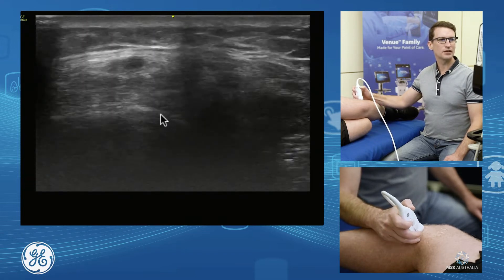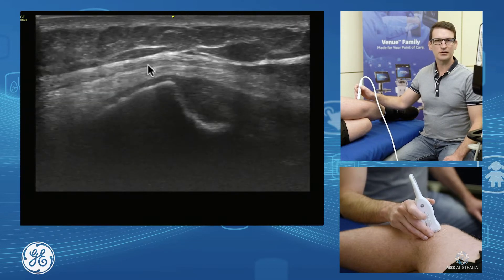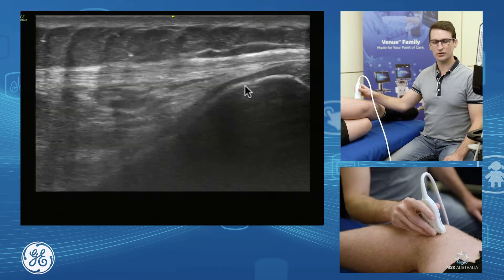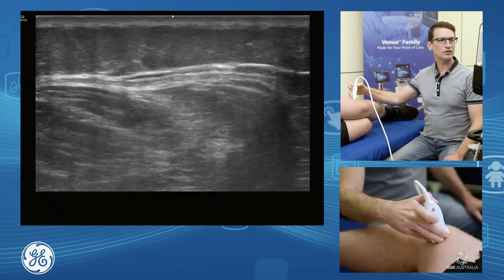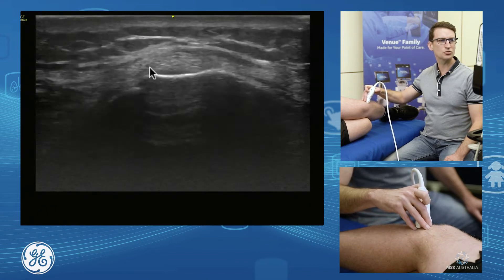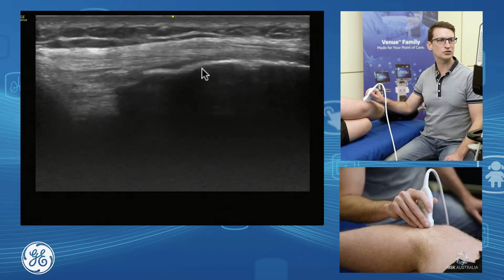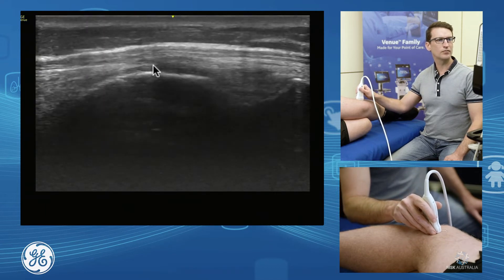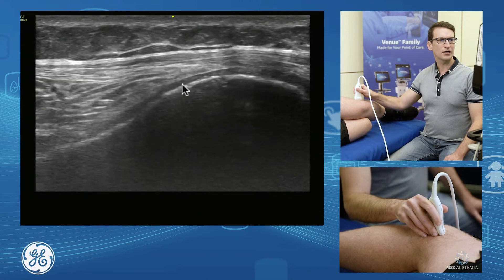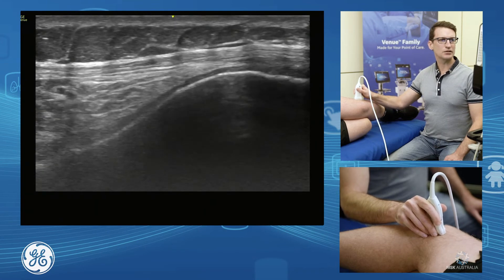Another thing we want to assess on our lateral knee is iliotibial band compression syndrome, which occurs just above our lateral femoral condyle. Our ITB runs down the lateral thigh, continues over our lateral femoral condyle and down onto our Gerdy's tubercle on the tibia — we can open that up and see the ITB insertion onto Gerdy's nicely. As we follow it up over the lateral femoral condyle, we have this little triangle of fat just here, and this is where we commonly see ITB compression syndrome with swelling and edema in the fat.